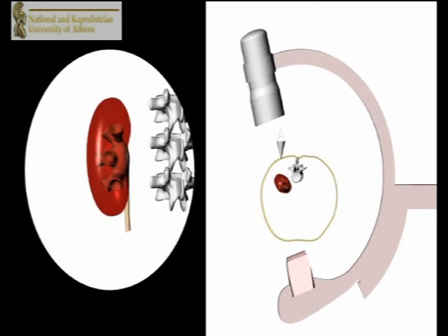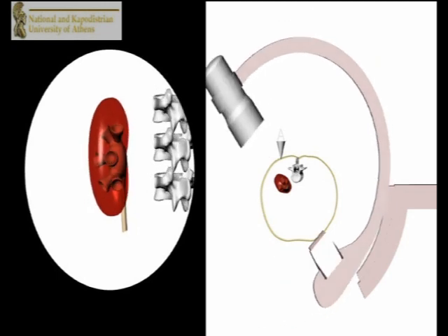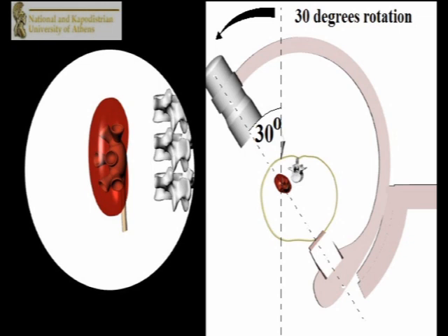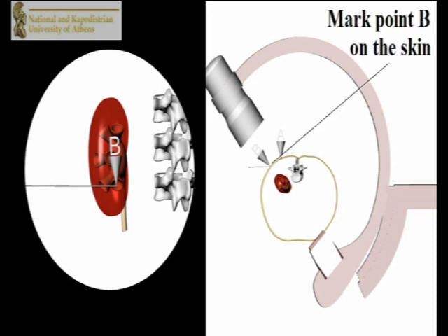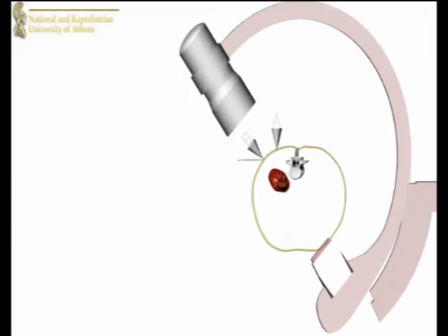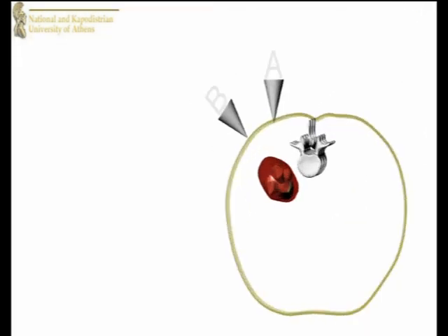This plane defines the medial extent of needle penetration for access to the desired calyx. The C-arm is then rotated 30 degrees towards the surgeon for an end-on view of the posterior group of calyces.